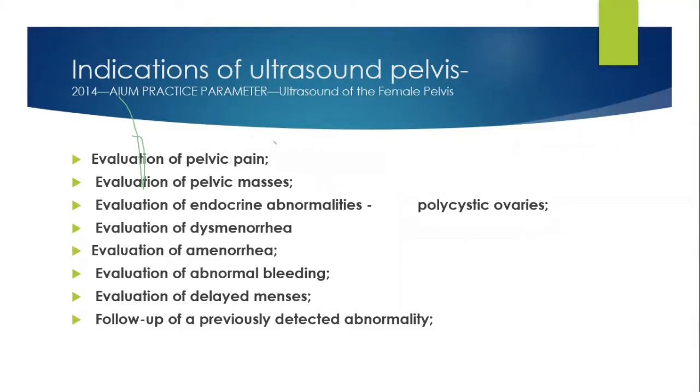We're not going to talk about all of this in detail because it has already been discussed. Now let us understand what the common indications are. Why do you want to do a pelvic ultrasound?